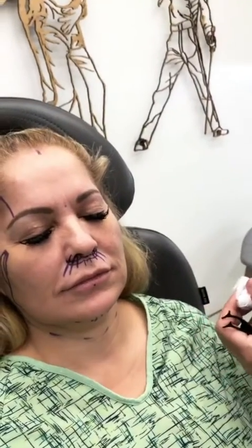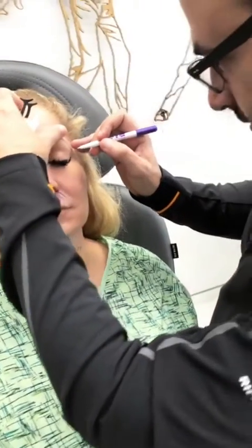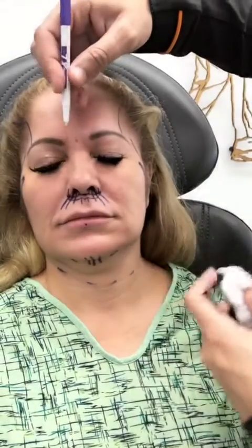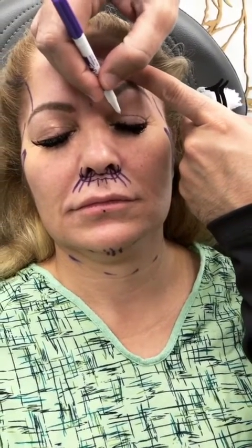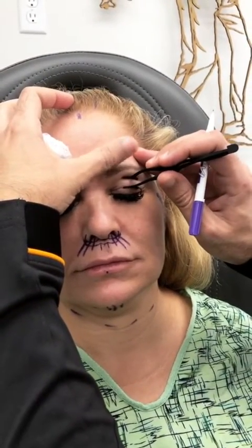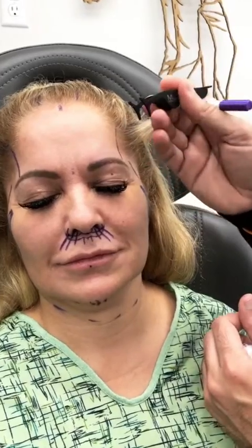So now the biggest challenge is going to be doing an upper eyelid surgery through these little eyelashes, through a forest of lash. Up your arm, close. So I got these new marking pens thanks to Jason Bloom, best doctor ever. The instrument I use to measure how much skin I'm gonna take and see if it's safe is the same exact thing that places eyelashes on. It's an eyelash placer thing.